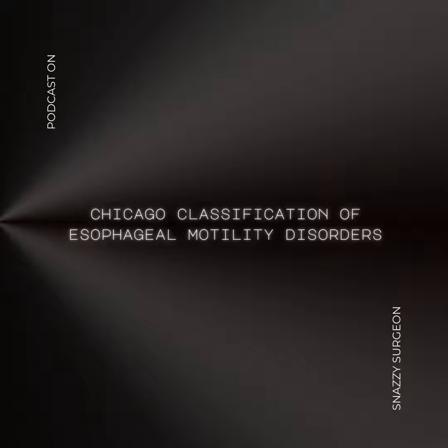And last but not least, type 3. I think this one is sometimes called spastic or vigorous achalasia, right? Yep, that's the one. Type 3 also has the high IRP and the lack of normal peristalsis. But what sets it apart is that we see these spastic contractions, defined by a distal contractile integral, or DCI, greater than 450 mmHg·s·cm happening in at least 20% of the swallows. So you've got the LES that won't relax, and then you've got these strong, uncoordinated contractions happening in the esophageal body. This one can be a bit trickier to manage. So type 3 kind of combines features of achalasia and distal esophageal spasm. It's definitely helpful to have that subclassification to understand the full spectrum.